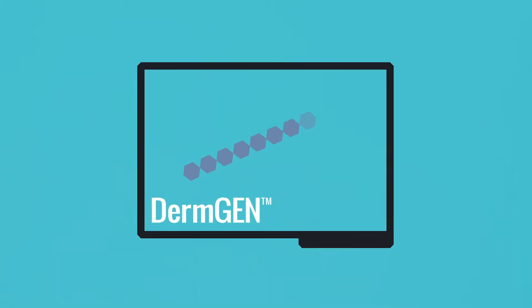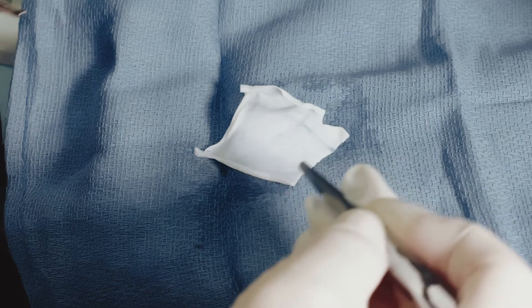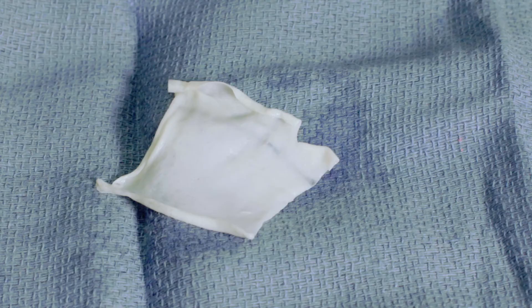The graft is provided in a hydrated state and does not require rehydration. Dermagen is provided with a basement membrane surface that repels blood and a dermal surface that absorbs blood. One of the keys to this product is putting it down on the correct sides — when the basement membrane is on the upper surface.